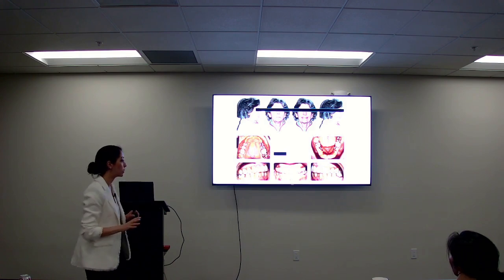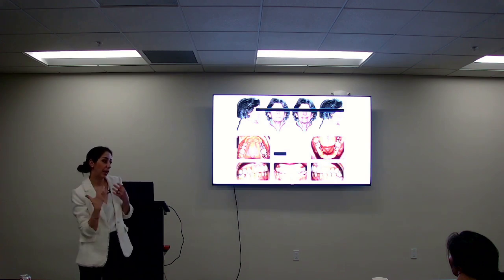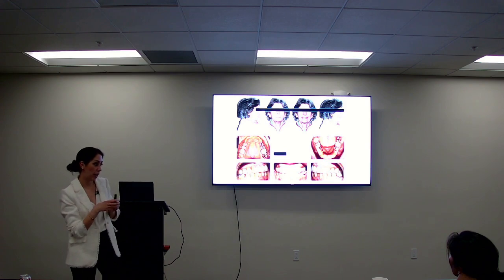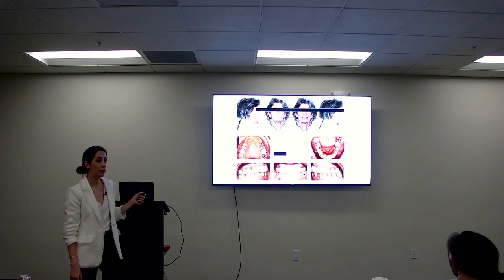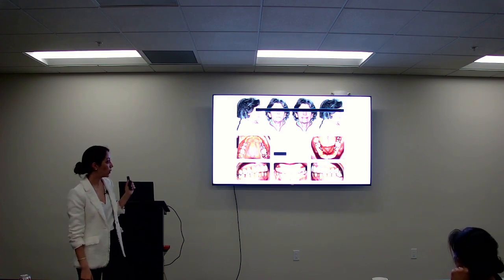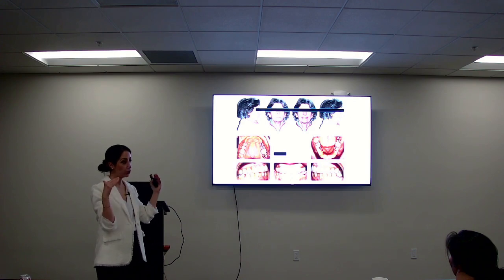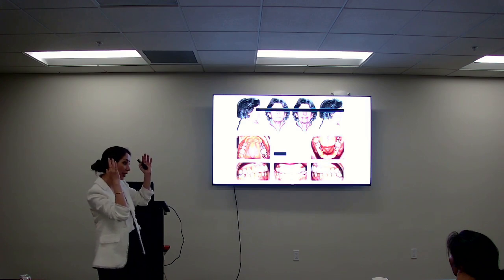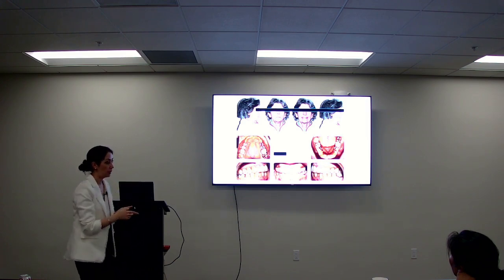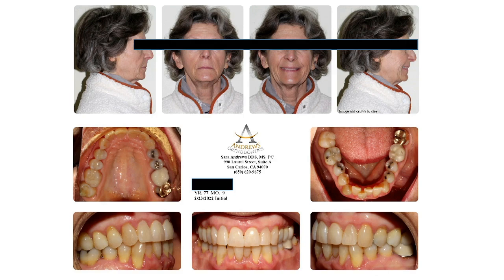In orthodontic school, that is one way of treating. If you have a tooth-size discrepancy, if you have mandibular excess, you have small maxillary laterals, and you're pretty class 1, you can get away with it. But the reason I don't like lower incisor extraction is black triangles, because I don't like black triangles. And also the other problem with that, when you take out a lower incisor, you narrow the mandibular intercanine width, so you lose your cuspid rise. You don't have cuspid occlusion because now your lower intercanine width is narrower and your upper is wider, so you just have too much buccal overjet on your canine. So anyway, I will basically never take out a lower incisor, even in severe crowding cases.